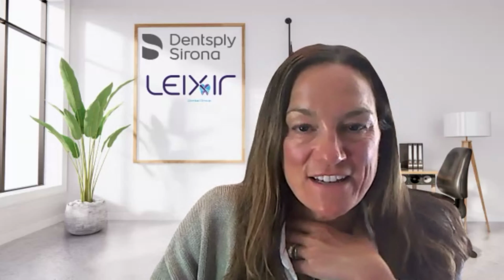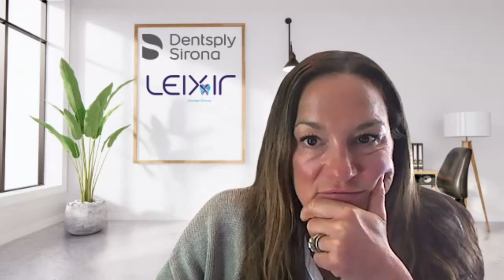I definitely see the advantages, from the lab side, of having things centralized and streamlined ways to communicate as well. And I know you mentioned earlier that it is an open system, so this is not just Dentsply specific. Yeah, we recognize that there's plenty of offices out there that have both PrimeScan and iTero, for example, if they're doing Invisalign cases and they have two different platforms for scanning.